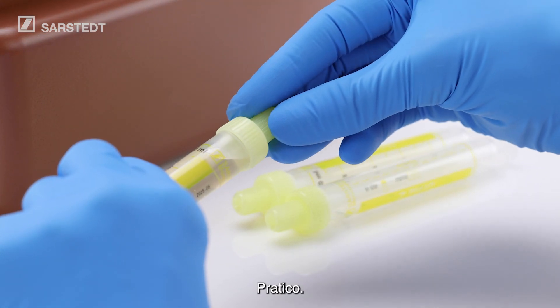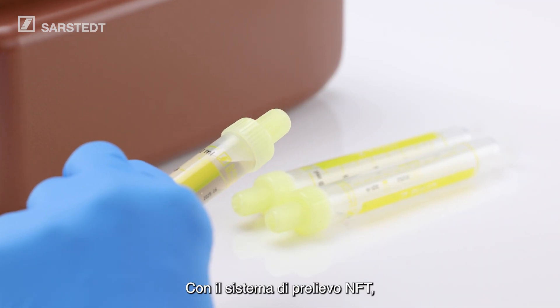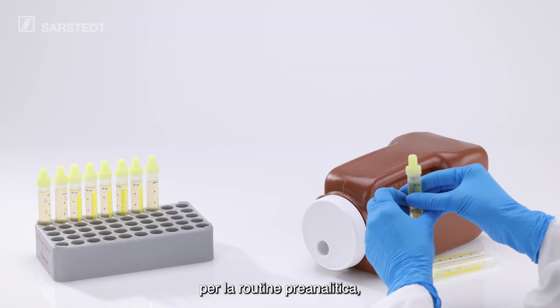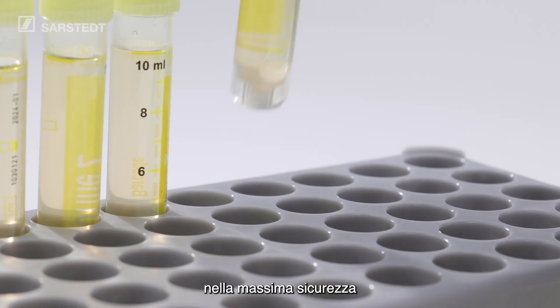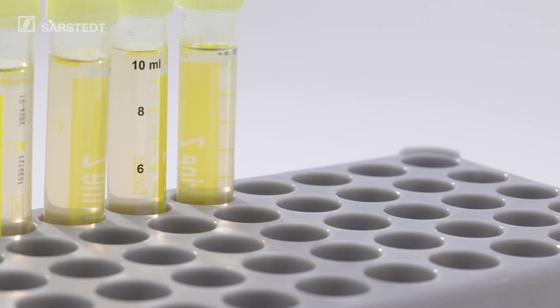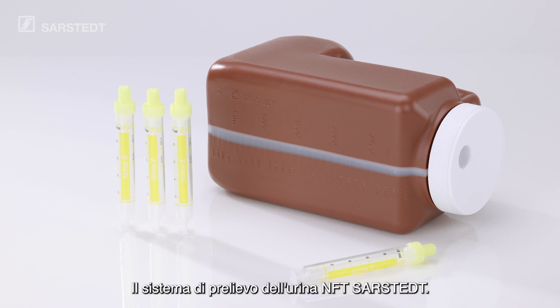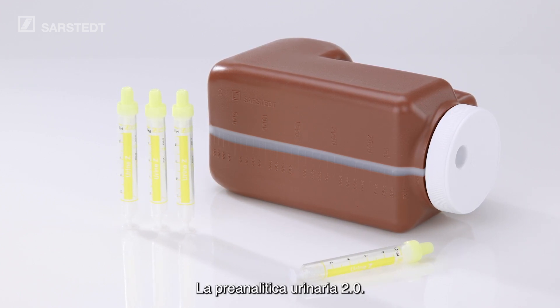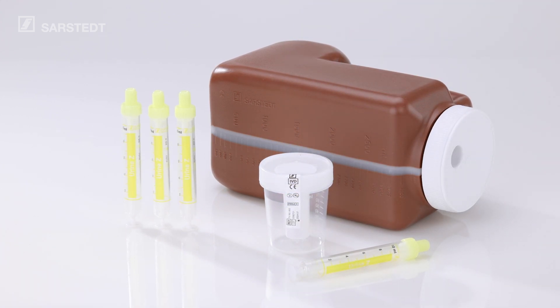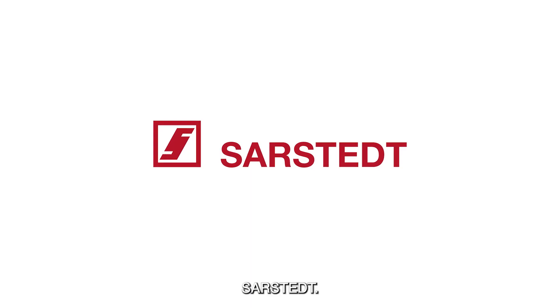Hygienic. Practical. Safe. The NFT collection system from Sarsted sets the new standard for accurate pre-analytics suitable for routine use, combined with greater safety for users and patients. The NFT Urine Collection System from Sarsted. This is Urine Pre-Analytics 2.0. Sarsted.